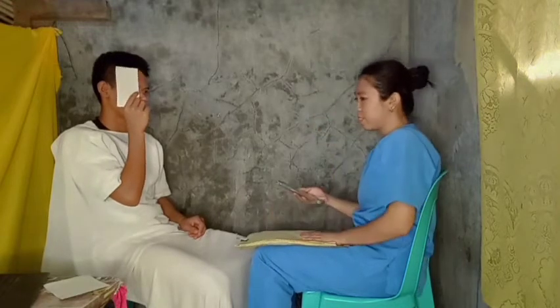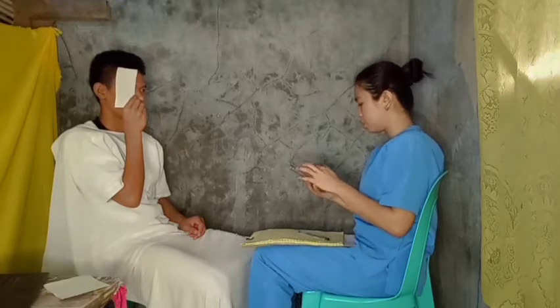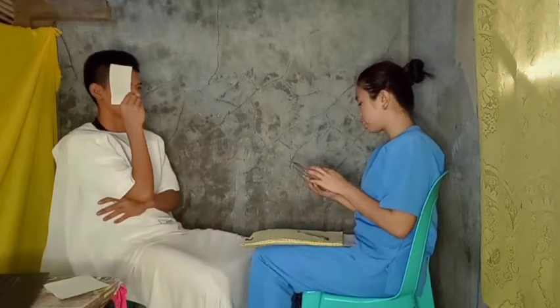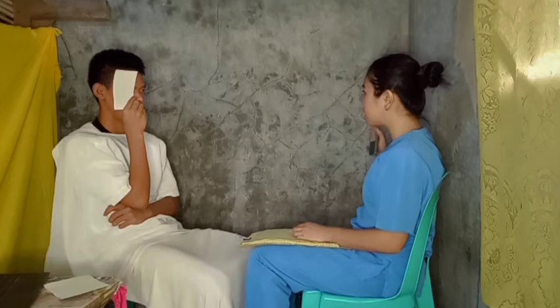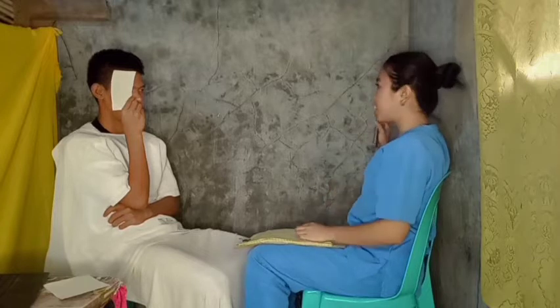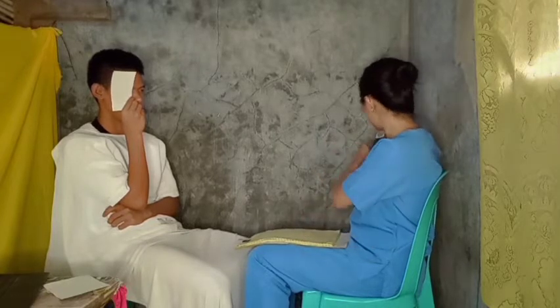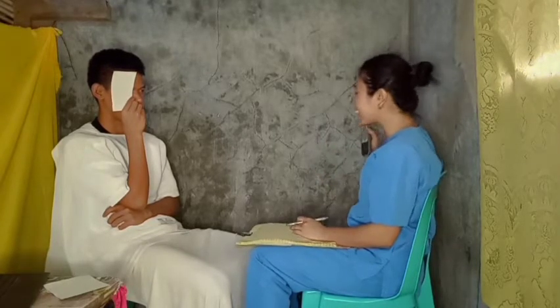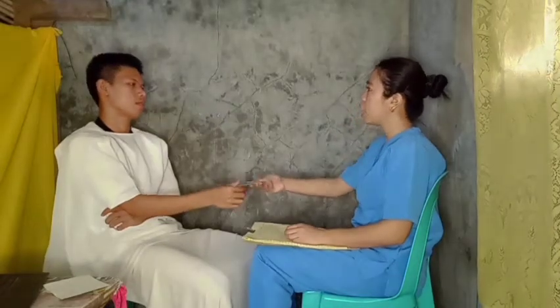Okay, sir. So I will be showing you colors and the plate with numbers on it, and you must identify what number it is. Okay, sir. 7-4. Okay, that's good, sir. 1-2. Okay, sir. Thank you, sir. 45. Okay, thank you, sir. And lastly, 15. Okay, sir. I think your left eye is properly functioning and does not have any color blindness.